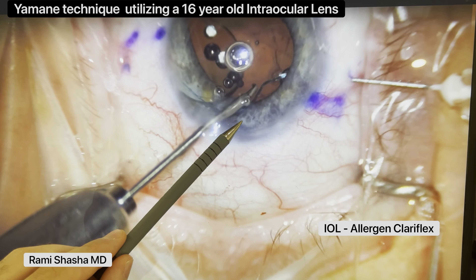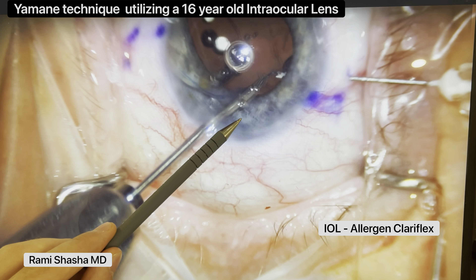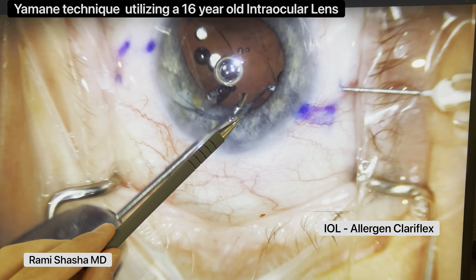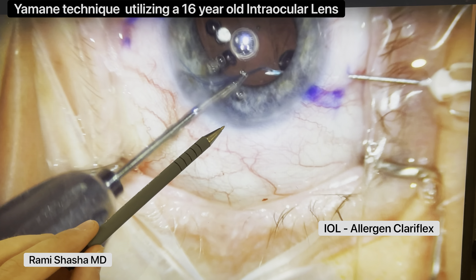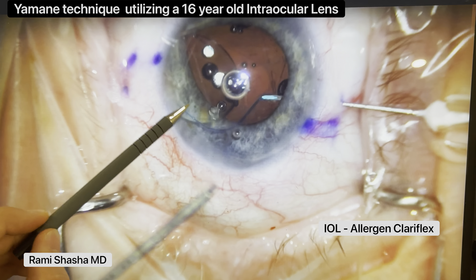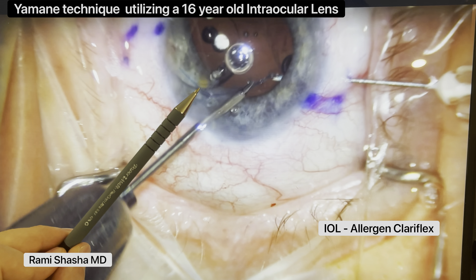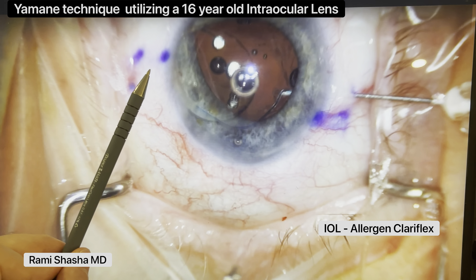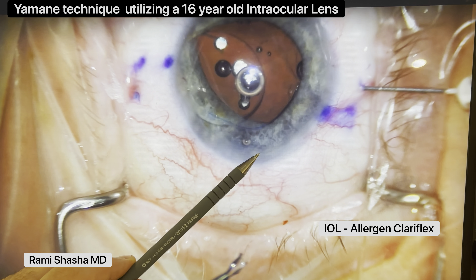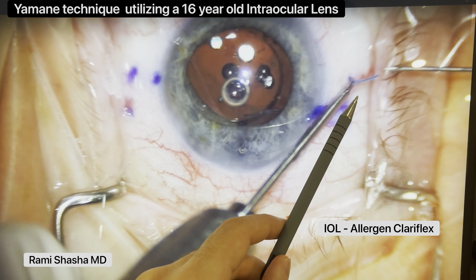Again, these are PMMA haptics — they're a little bit more tricky to maneuver. But I managed to kink it back into position. The moment of truth here is I'm going to externalize the needle. The kink — I'm trying to reverse the direction of the haptic. I don't want the haptic to slip out in any way, shape, or form. Just taking my time. Either the needle will externalize the haptic or it won't. And fortunately, it does, and the kink is not too big of an issue at this point.